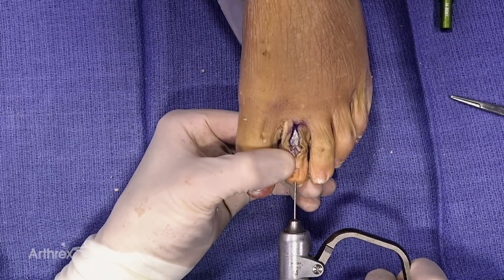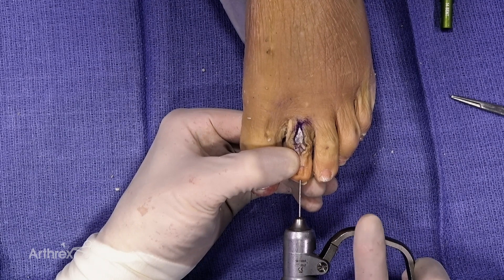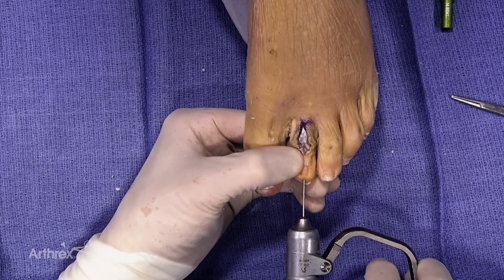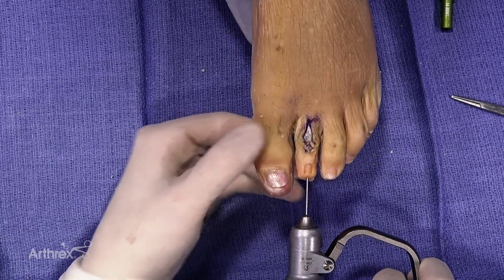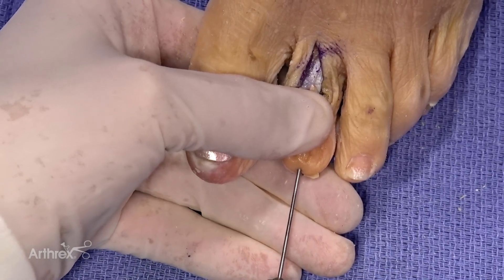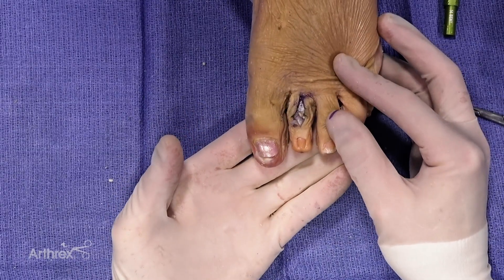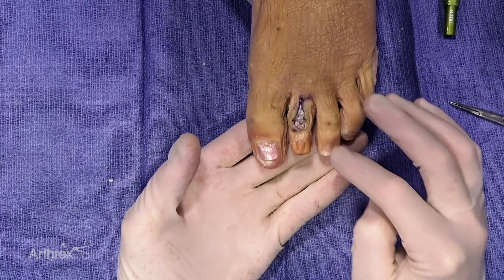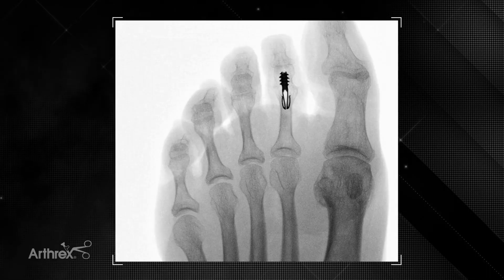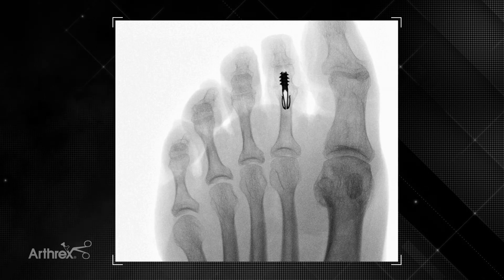You now have a couple of options. You can remove the K-wire, or if you want to bring it further down towards the base of the phalanx for additional stability, that will push the barbs further up against the cortical bone inside the phalanx for a lot of stability. You can also advance it even further across the MTP if you desire for other pathology. In this particular case, I'm going to remove the wire, and the implant holds very nicely — the toe in the corrected straight position with a slight 7-degree angulation. Final fluoro x-rays confirm the joint has come together. We have good apposition, the implant is well centered with excellent stability. We haven't gone too far distally breaching the DIP joint, and overall alignment looks great. The patient will be very satisfied with this.